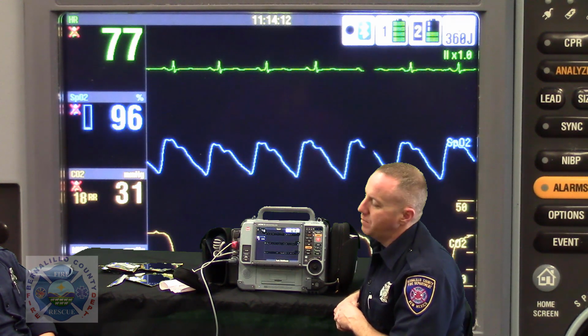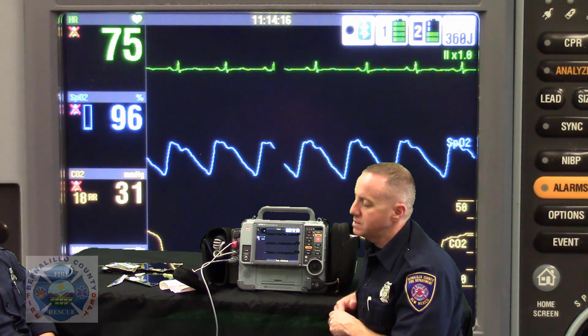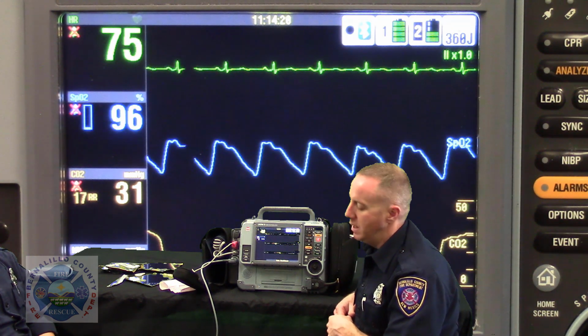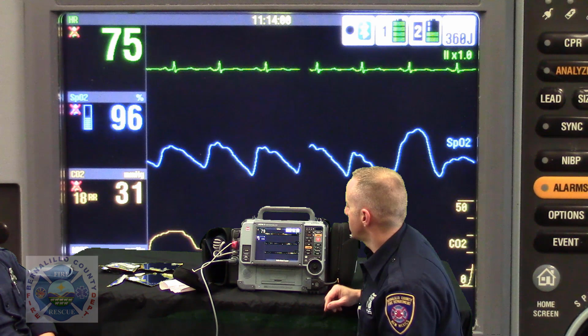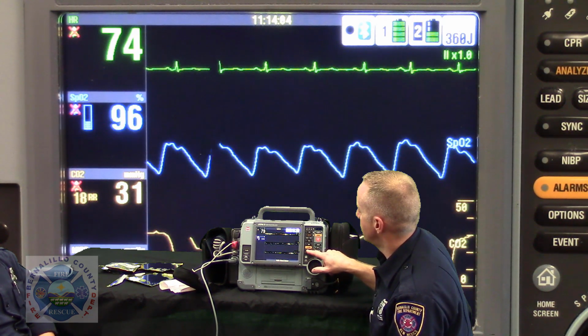Again, we've explained to them that we need them to hold still. The person who's been acquiring their vital signs is still sitting with the patient and they're coaching them through the EKG. It's going to take about 7 to 10 seconds for the monitor to pick up an EKG. So let's go ahead and enter our patient demographics and get ready to send this EKG.